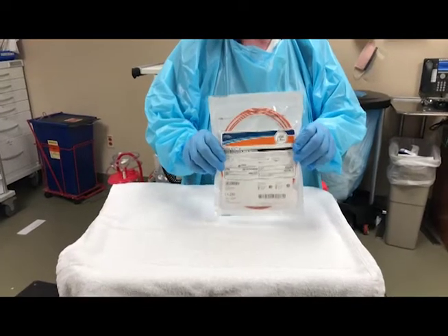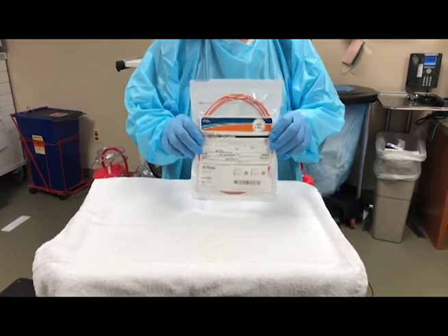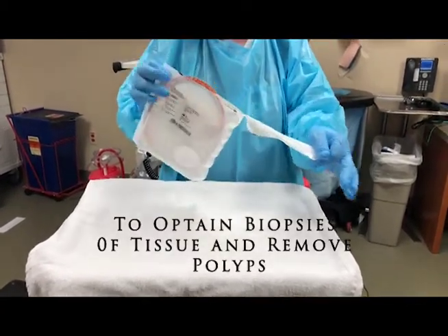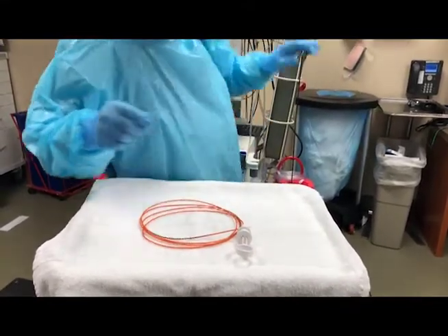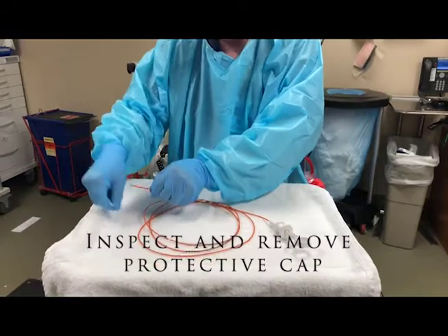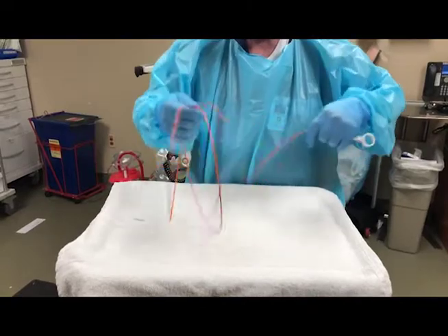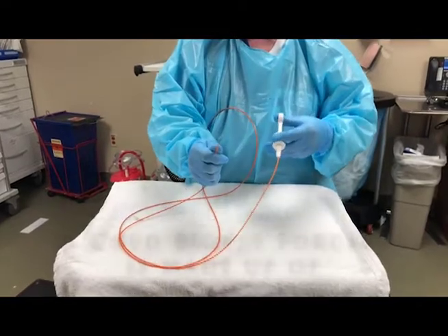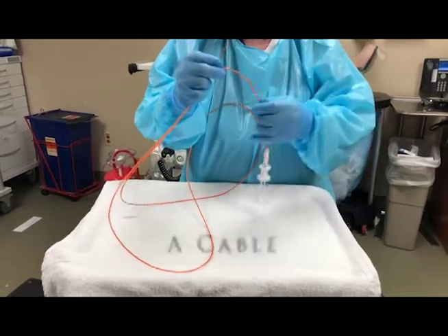This is a cold biopsy forcep. It's used to take tissue biopsies and also to remove polyps. To open it, simply pull across the top. To take out the forcep, the first thing we're going to do is inspect it for any damage — make sure there's nothing sharp on it that shouldn't be there. So we will uncoil it and make sure it opens and closes properly. You'll notice it has a handle, it has a cable.